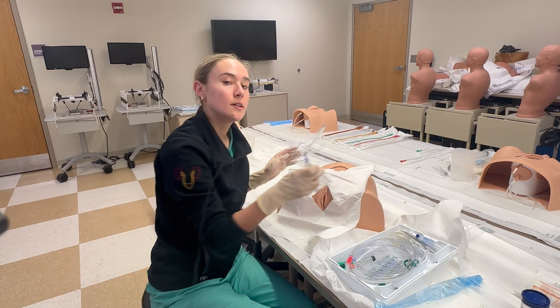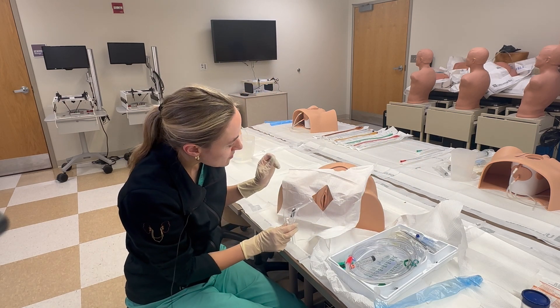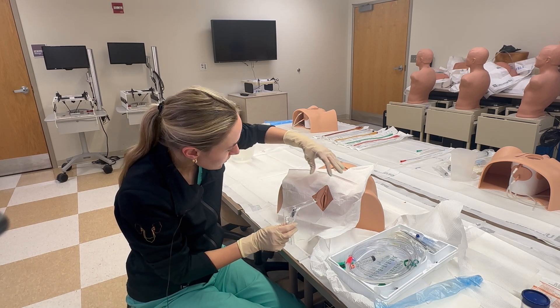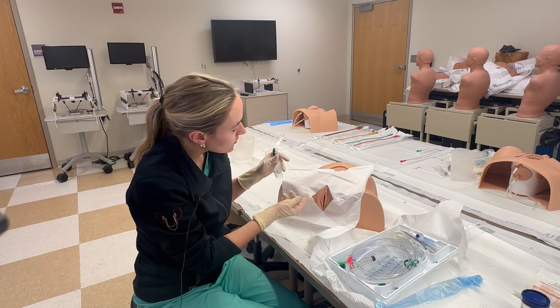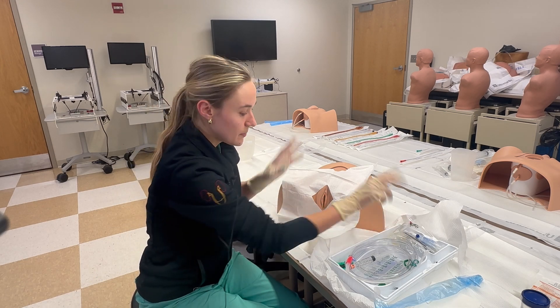Another thing you can do is take a speculum and, with permission of the patient, place the speculum within the vagina — that can also help you find the urethra. Another thing you can do, again with the patient's permission, is put a finger within the vagina and find the urethra by feel.